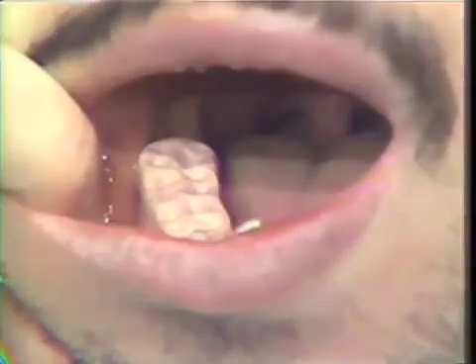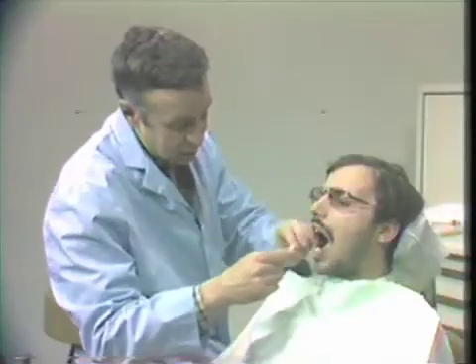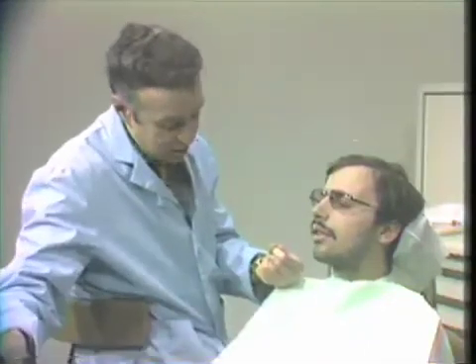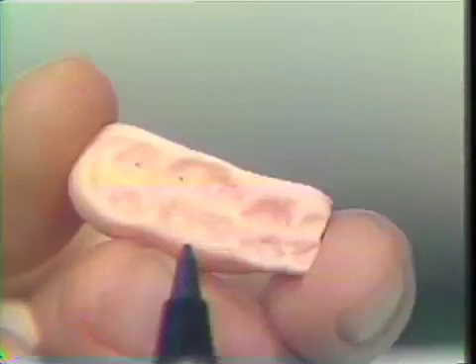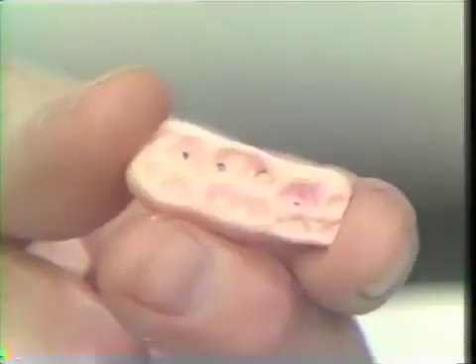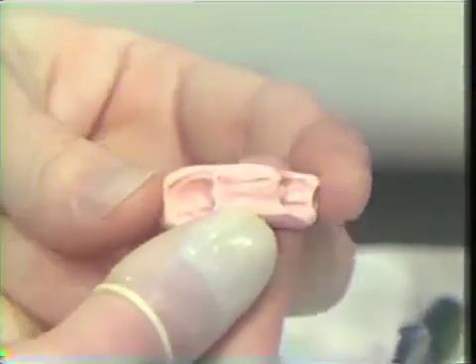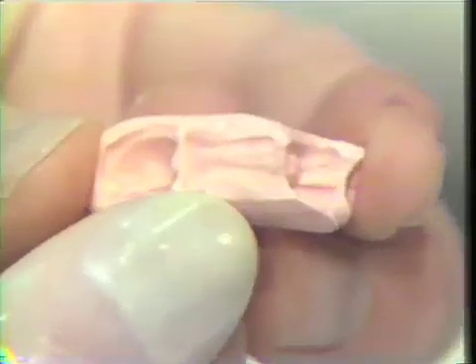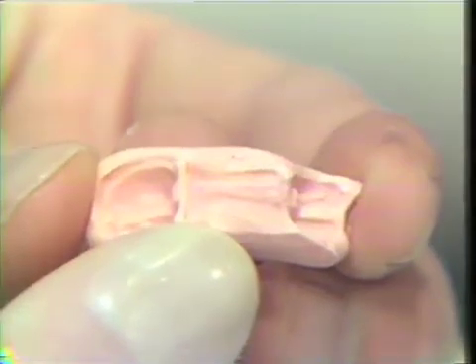The material has now gone through its polymerization state, and during this process we did remove it several times to prevent any damage to the pulp tissue. And here you can see that we have registered the opposing dentition in the acrylic quite accurately, and we will mark the lingual cusp tips to give us a guide as to how much we would like to reduce this platform for our wax. You can also see that we have registered the detail of the preparations quite accurately in this particular material, which will give us a very stable base after it has been trimmed.